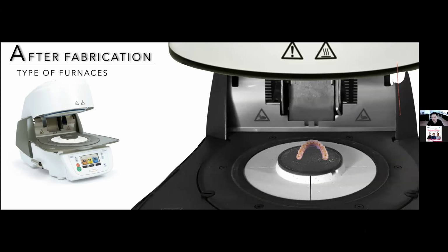Maybe in this case, please put your restoration, your crown and your bridge closer to the back, behind, and make the parallel side in the front, because this area is empty. So maybe it releases the heat more quickly, and that is no problem.